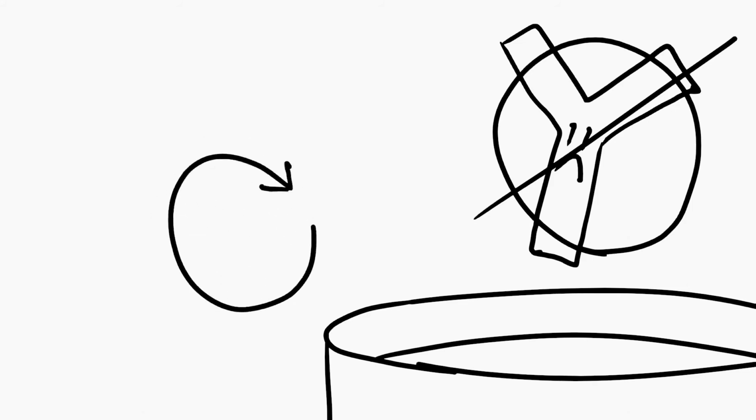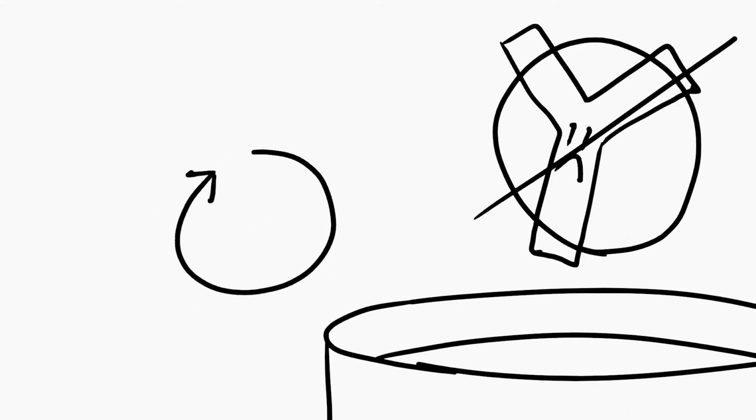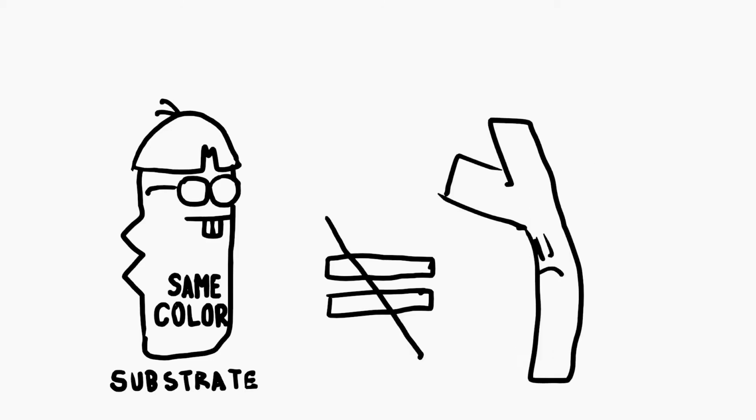These secondary antibodies would bind to the primary antibodies and would change color if exposed to the substrate. If there's a color change, then this indicates that the presence of anti-COVID antibodies are produced by the patient. If there is no color change, then that means that there were no primary anti-COVID antibodies for the secondary enzyme-linked antibodies to attach to.